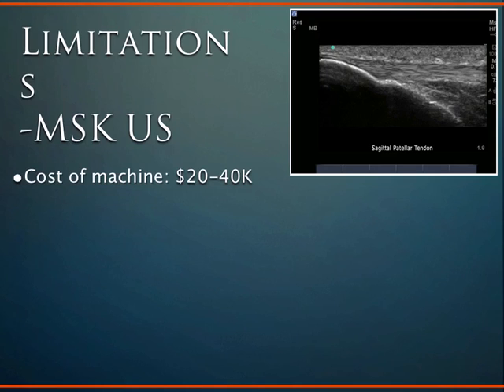In terms of limitations, though, it certainly can be expensive. These machines are not cheap, and if you're in a private practice or you're starting up a practice or even an academic situation, there is a significant investment. So there's a lot of front end costs, but in the end it can pay off in terms of the accessibility for the patient and accuracy of diagnosis and accuracy of procedures, injections. We'll talk a little bit more about that.